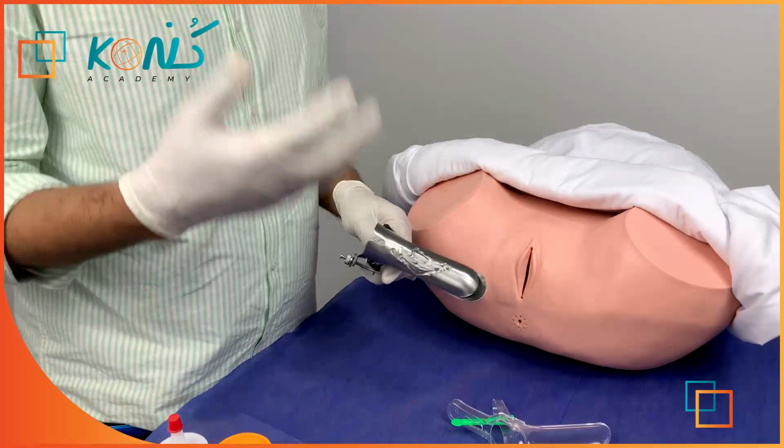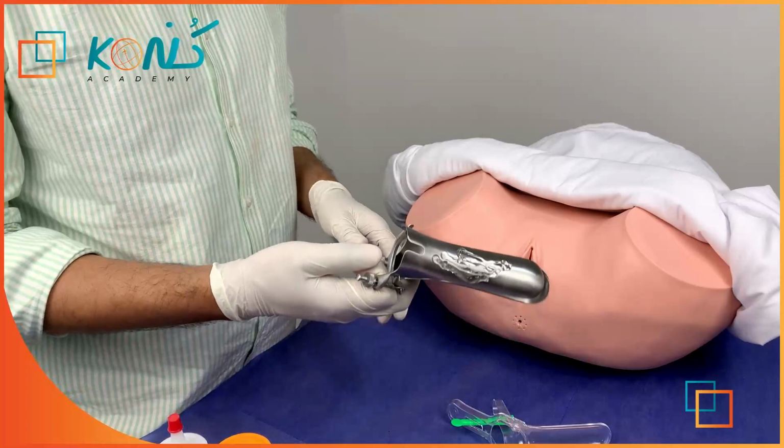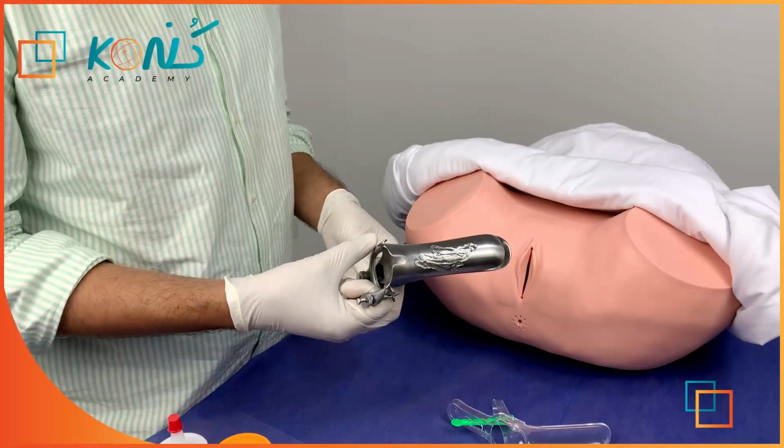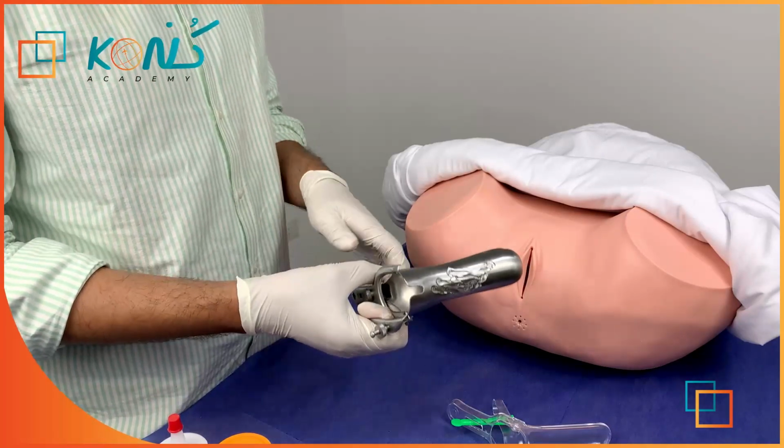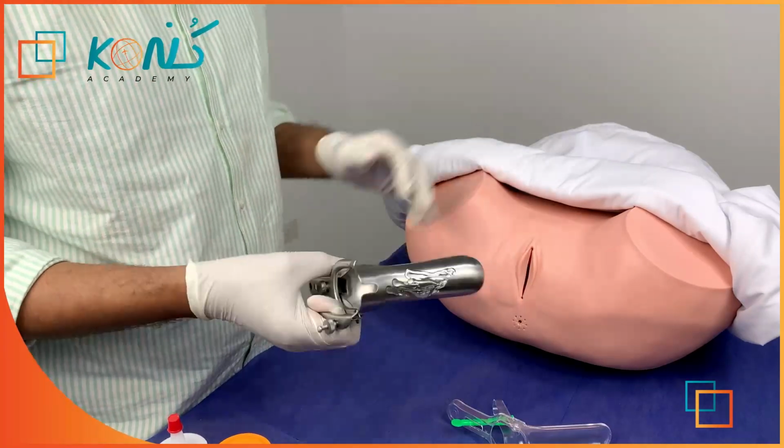If you didn't want to, just simply explain to her that you will put this device and have a look around the cervical canal, and you will take a sample from the cell lining to examine it under microscopy to see if there are any virus or abnormal cells, it will be all right.